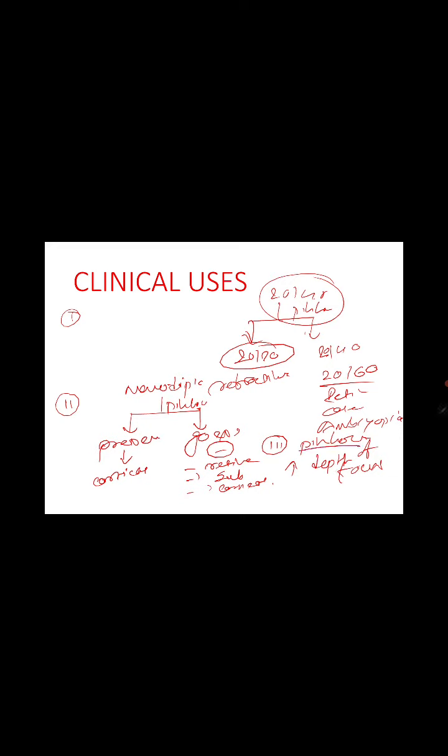When you put a pinhole, there is an increase in depth of focus, which also helps us understand that if we get a patient 60 years old with a small pupil, then there is also a pinhole effect, which creates a decrease in near add, and he is reading very well with less power, which all correlates with depth of focus and the pinhole.